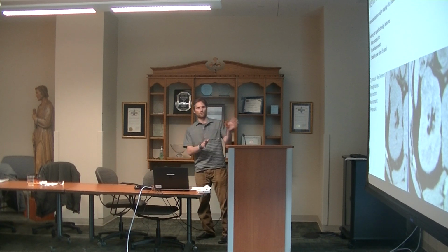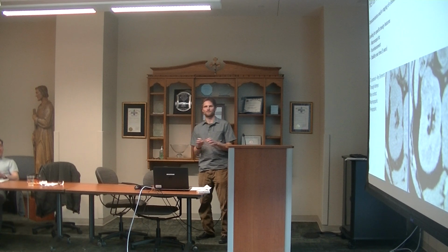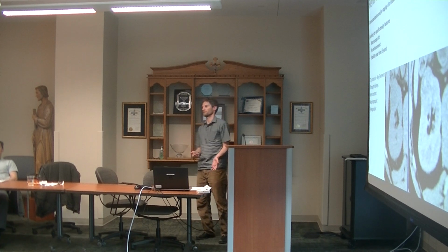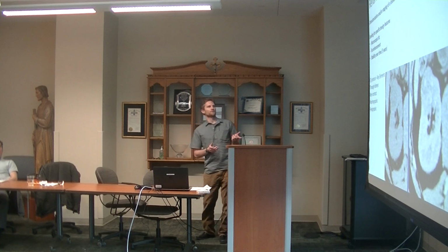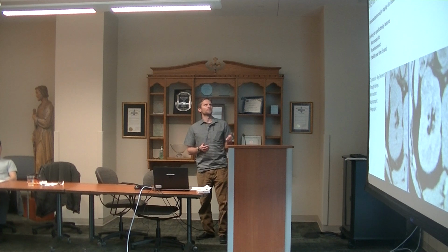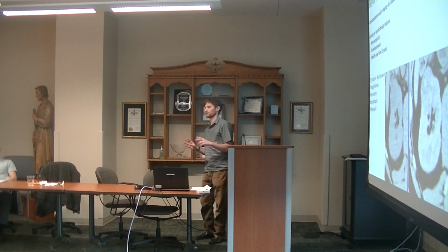So I wanted to go over these just to familiarize yourself with them. This is the majority of the indications for these cases that you'll see. And if they don't fall into one of these categories, you want to question it and go over it with the radiologist. So the first one is the renal mass protocol. This is for characterization and staging of a known renal mass that's otherwise indeterminate.